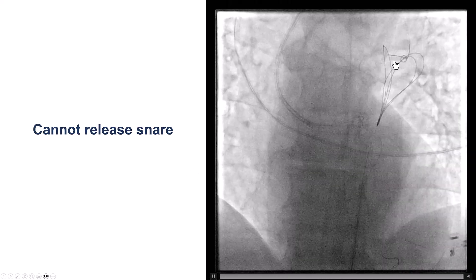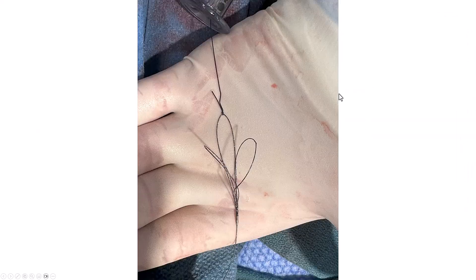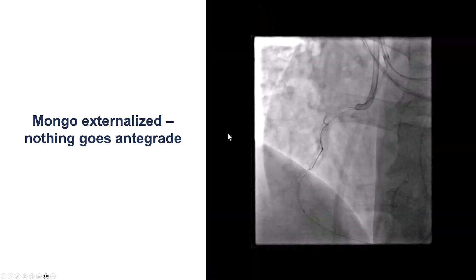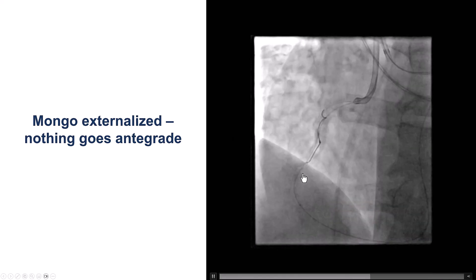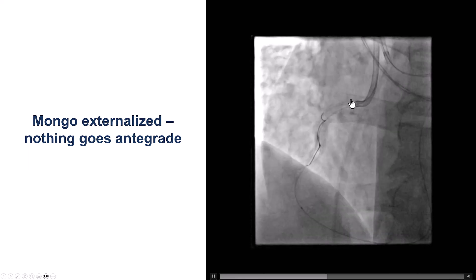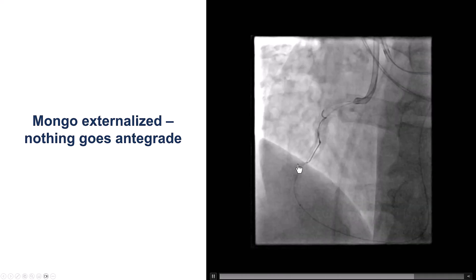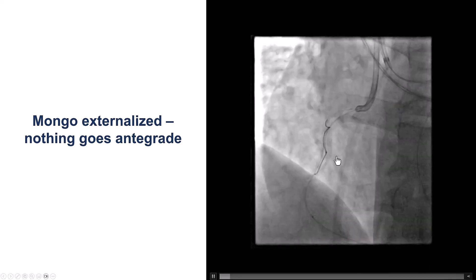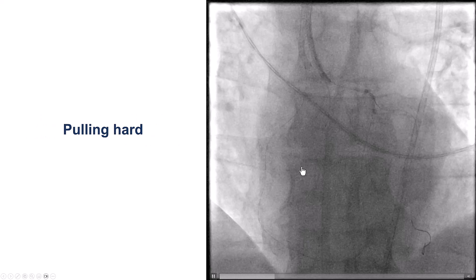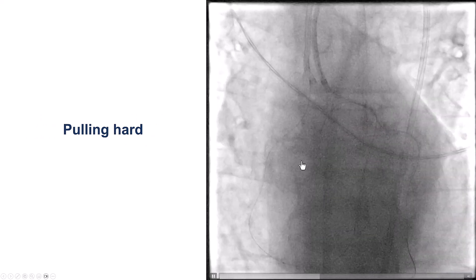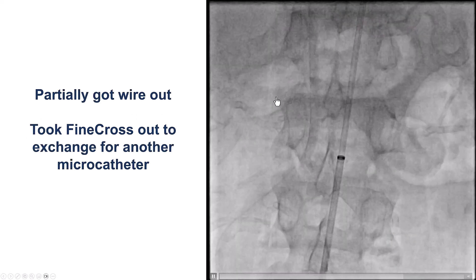As often happens with snaring, we could not release the snare, so we ended up externalizing. This is the snare bringing back the Gladius-Mungo guide wire. We thought that after externalizing we should be able to go antegrade and treat the lesion, but unfortunately we couldn't deliver anything antegrade. Likely because of a combination of calcification and tortuosity, no balloon would go past the proximal RCA — it would not even reach the level of the occlusion. We tried several techniques, but eventually it failed and we decided to bail out.